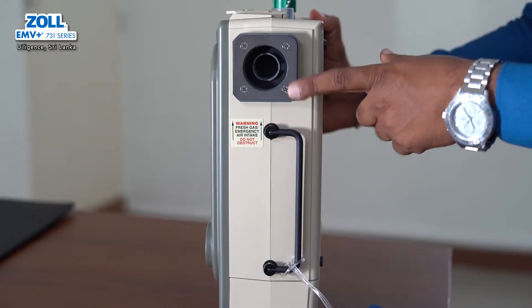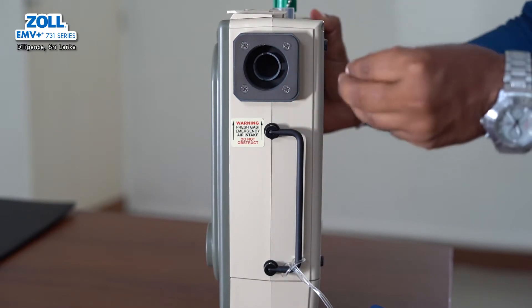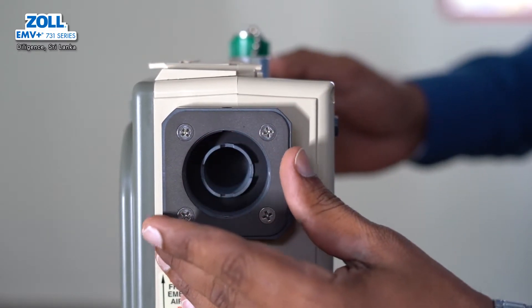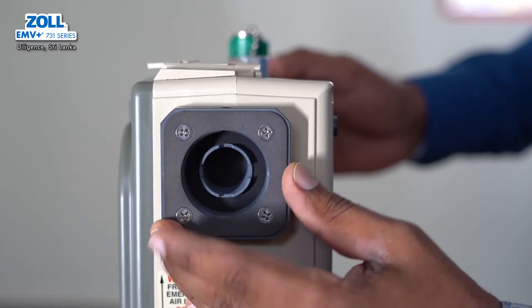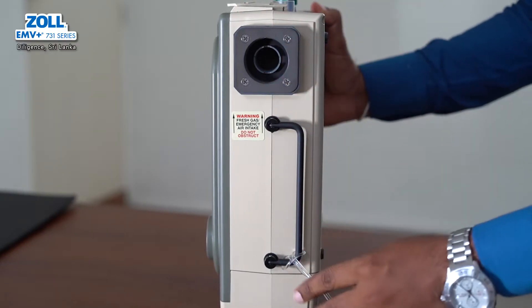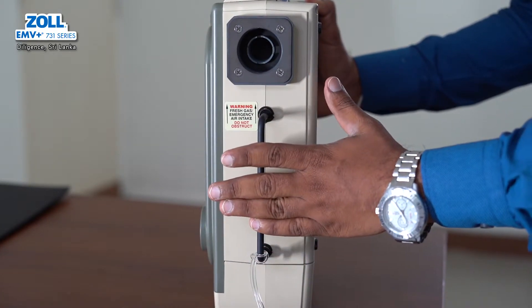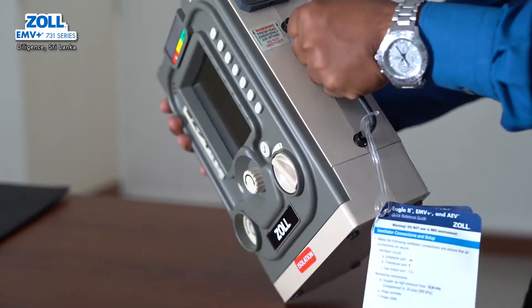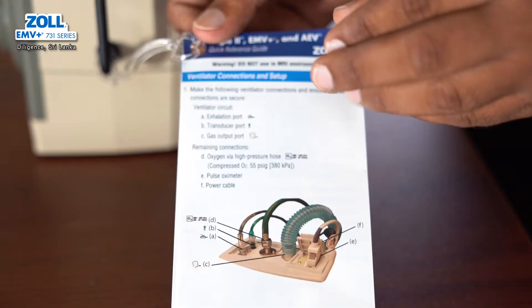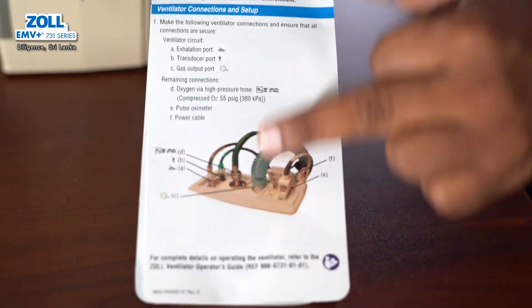This is the air intake. The machine takes in normal surrounding air. There are dust filters, and this is the BV filter. This is the handle. The machine weighs 4.8 kg. This is the quick reference guide. You can still operate the machine by connecting the tube connection to the panel.